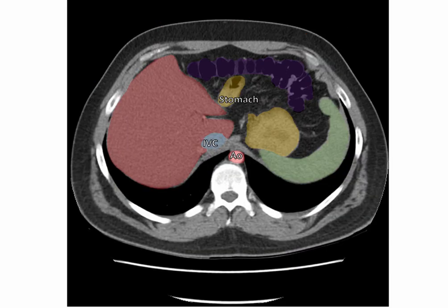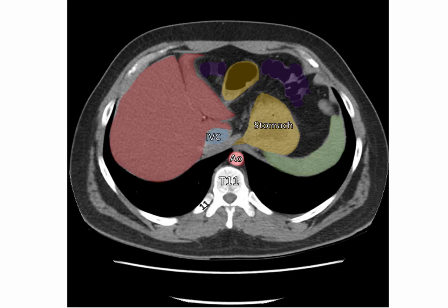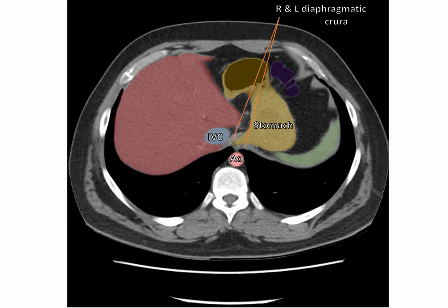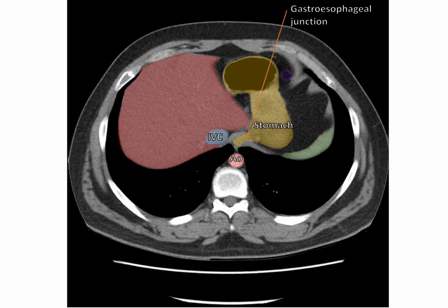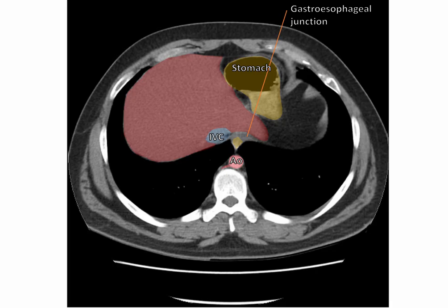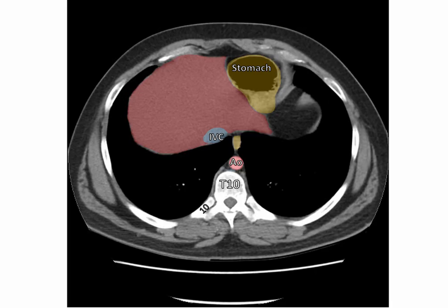As we move to vertebral level T11, we can start to see the right and left crura of the diaphragm, and how the esophagus is beginning to penetrate the right crus. This is marking our gastroesophageal junction. The profiles of the abdominal organs are beginning to diminish as we begin to move through the diaphragm. At the T10 level, we can see the profiles of two veins here, either side of the thoracic aorta. These are the azygous and hemiazygous veins. Also visible are the posterior intercostal veins, which are draining into these vessels.